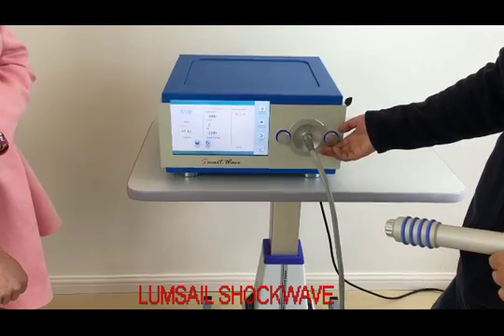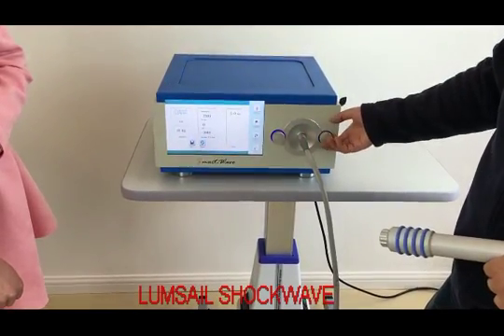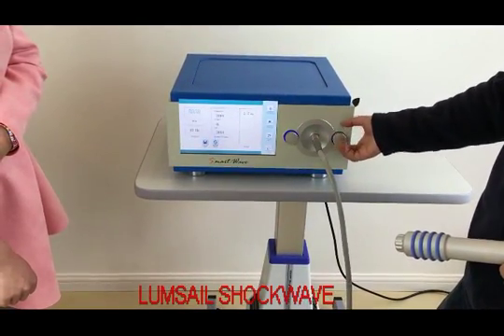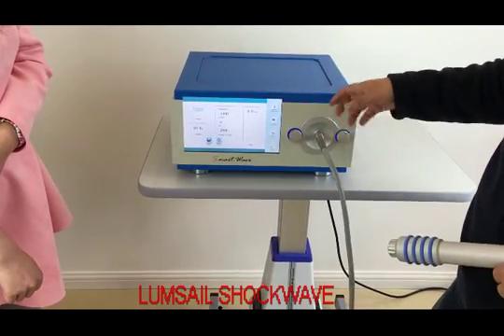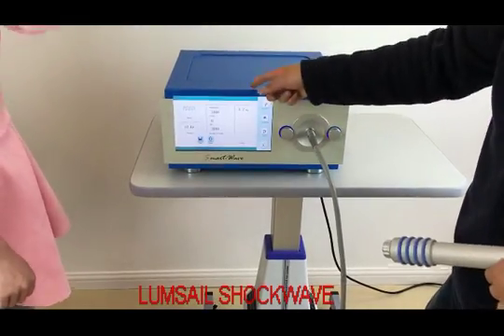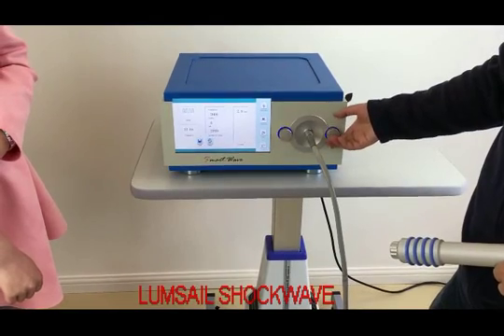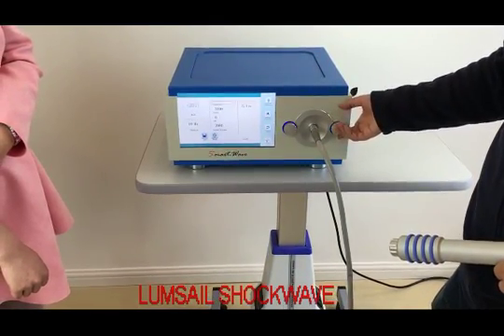For energy, we use this knob to adjust the energy. The lowest setting is 2.0 bar. For this machine, we set the highest to 4 bar and reserve the capability of 5 bar. But typically, 4 bar energy is enough for most diseases. We are going to demo how to operate the machine. We set the energy to 2.0 bar.